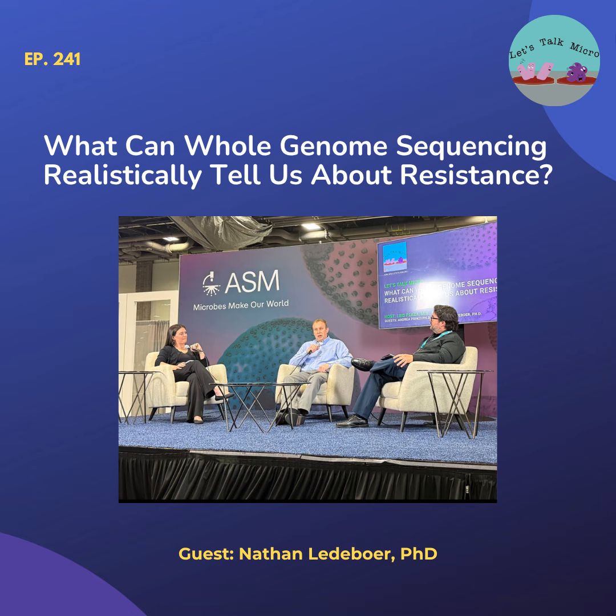And oh, by the way, based on the sequencing data, we know they're related, 99% chance. We probably need to initiate an epidemiological investigation in terms of what's the link to this and how can we stem that. So there's really a potential with a lot of these advancements in how and where the data is stored to actually do epidemiological work on a prospective basis rather than retrospective.